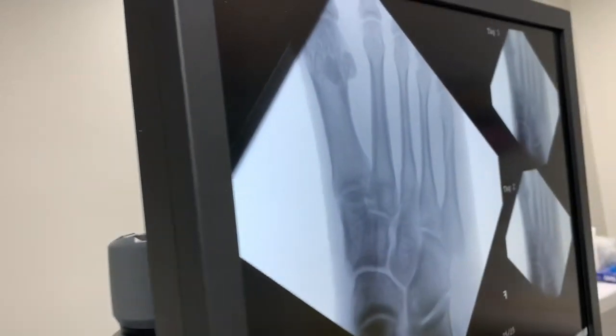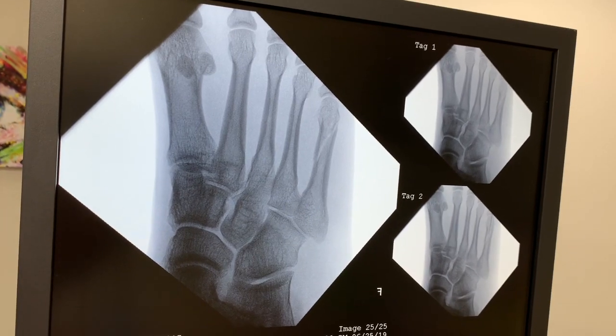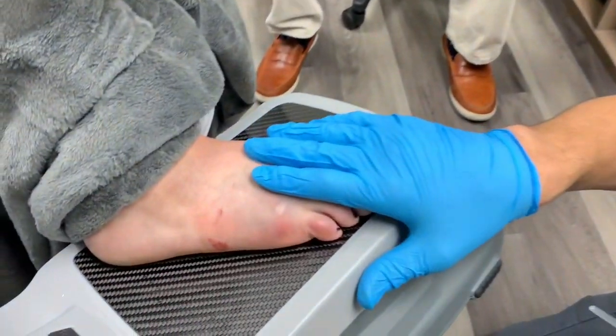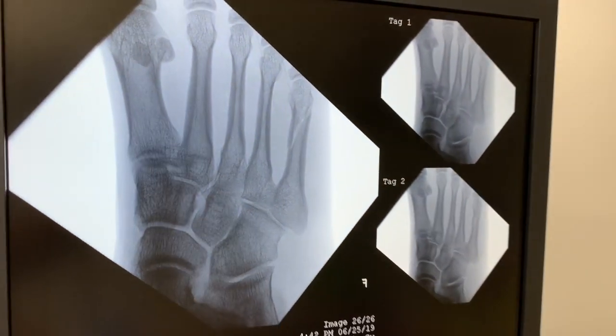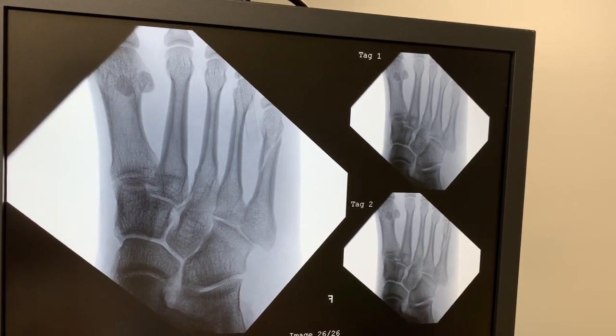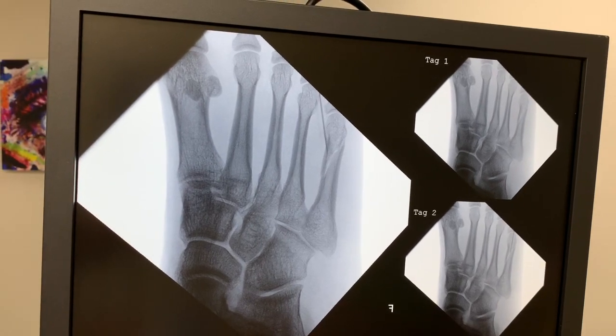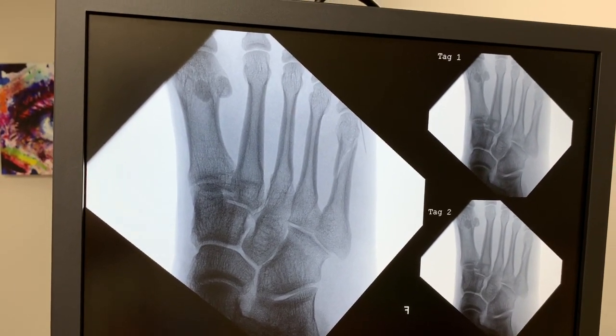Come around — it's not about me, it's about what we're doing here. Take a look at the fifth metatarsal. This is only one view; if I move the foot around you'll be able to see bigger gaps throughout. The foot is already on the mini C-arm. I'll go ahead and go live so everyone can see what I mean by this machine. Look at the needle — it's a live image. We're going to inject all of this area with PRP and marinate it.